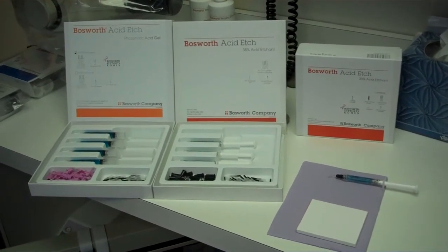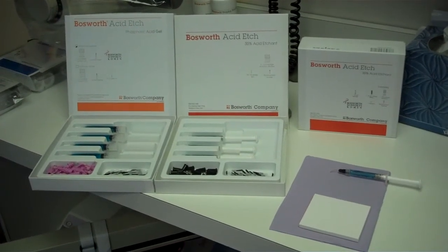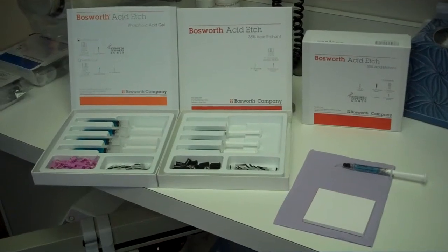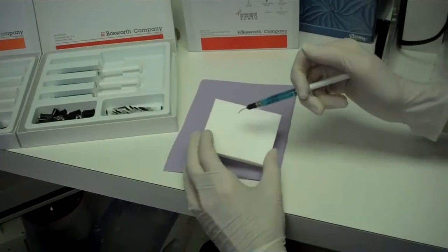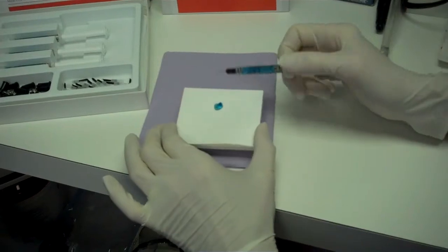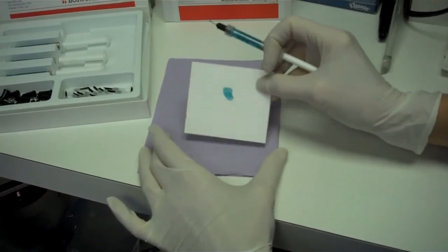Bosworth Acid Etch creates a deeper etch pattern for easier application of all your bonding materials. It is highly viscous for accurate placement, and yet it is easily and completely washed from the etched surface with no taste or odor for the patient.